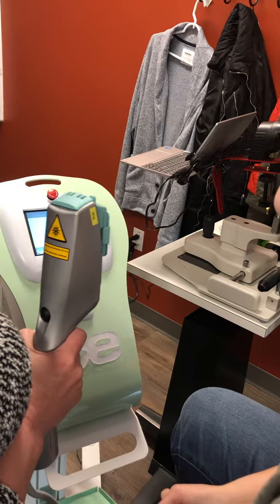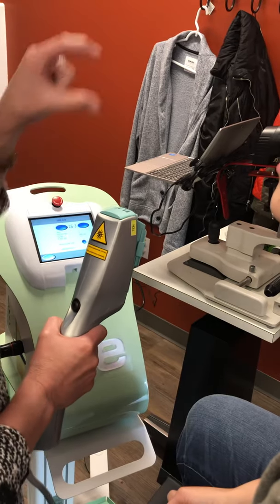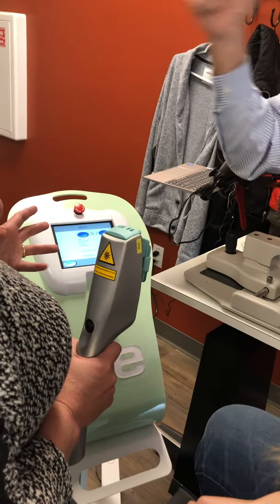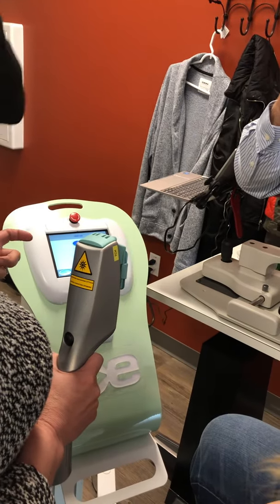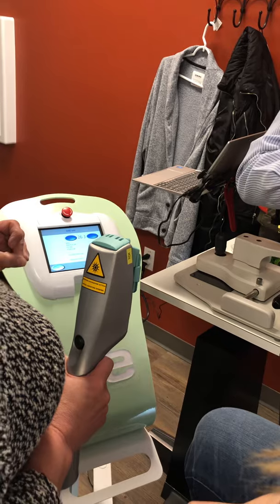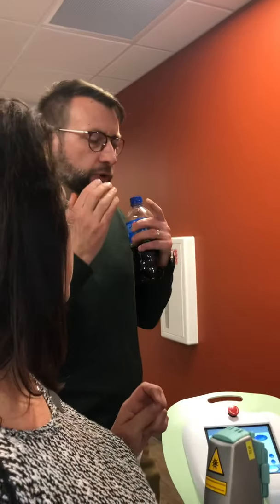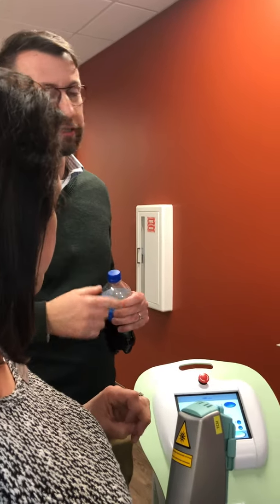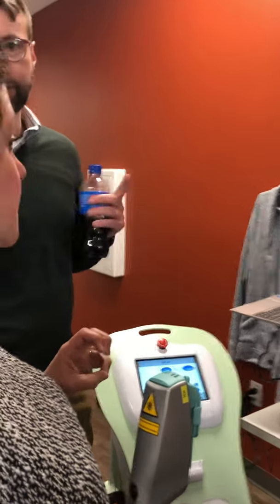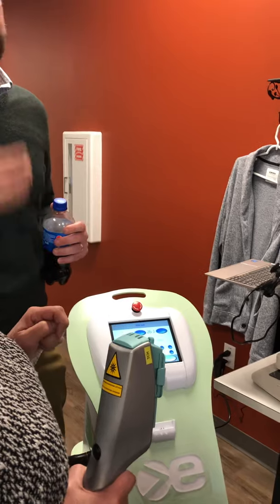I'm with you. So like that scenario though, are most docs, you know, you gotta tell the patient, I'm not gonna do this. I mean, you want me to touch a little bit here, there too. Well, when you start to talk about cosmetics, one, we're out of scope, and number 2, then that may be another treatment regimen where they go, hey, I understand that you can do this and that with it, and you go, sure, wink, wink. I think the way that I would handle that is to say, we discovered that this improves dry eyes through dermatology. And the dermatologists were treating the entire face. If we have reasons to extend outside of the eyes and the orbits, we'll go ahead and do that. You're going to get extra treatment and extra benefits. And you just extend out to those areas.